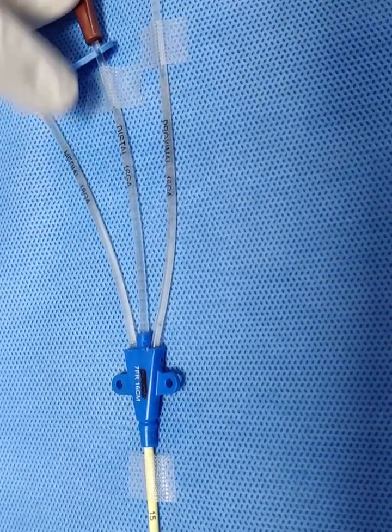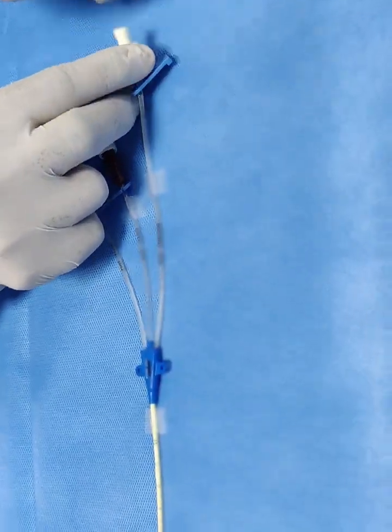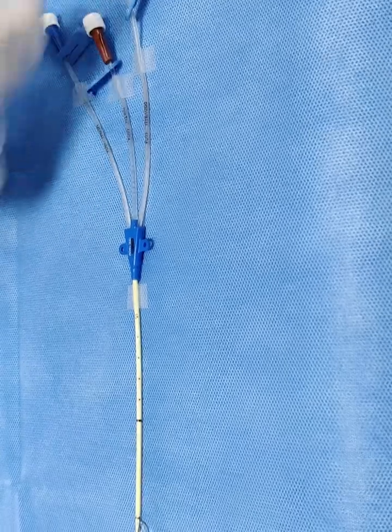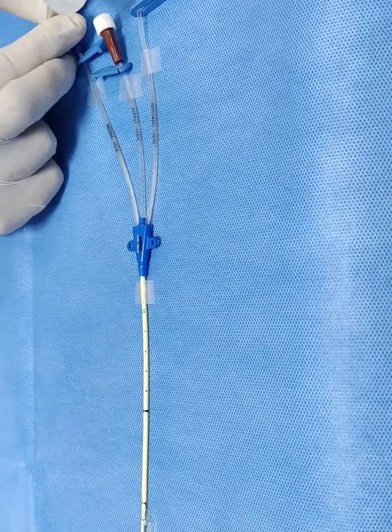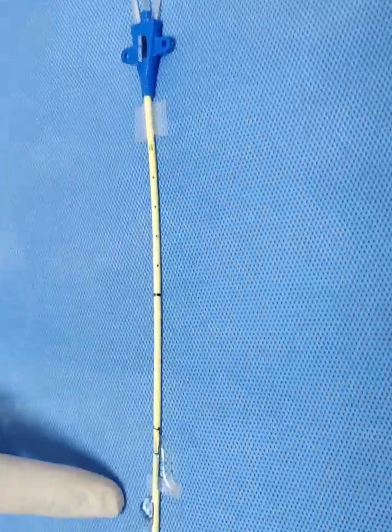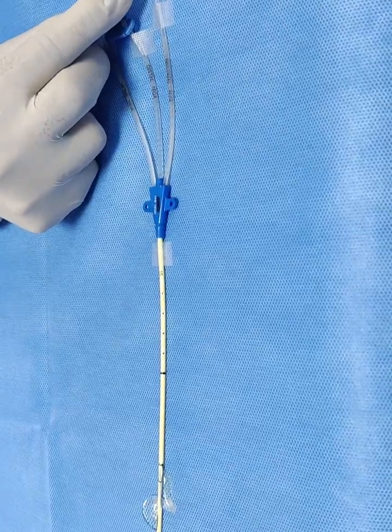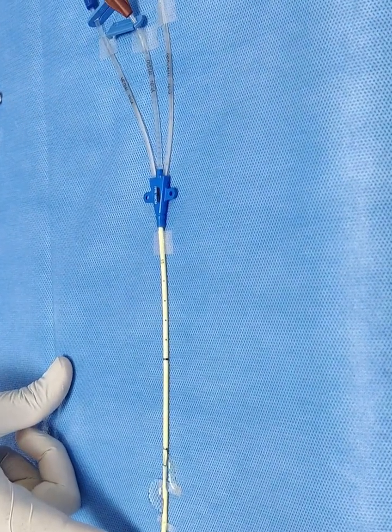I will flush each port so you can see them easily. This is the proximal port — you can focus here and see the fluid coming out of it. This is the medial port — just focus from here and you can see the fluid coming out of it. And now the remaining distal port — it opens at the tip, you can see the fluid projection.